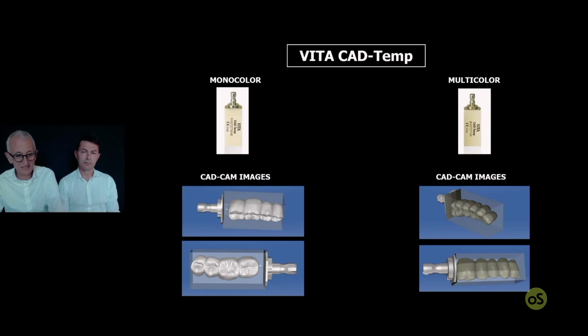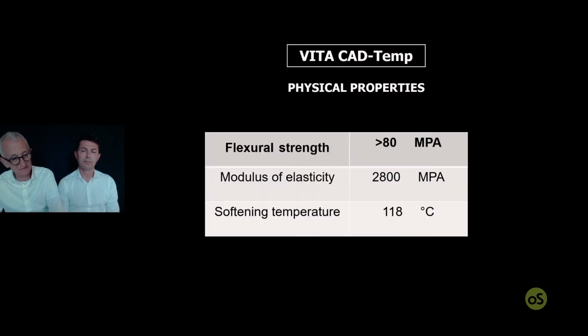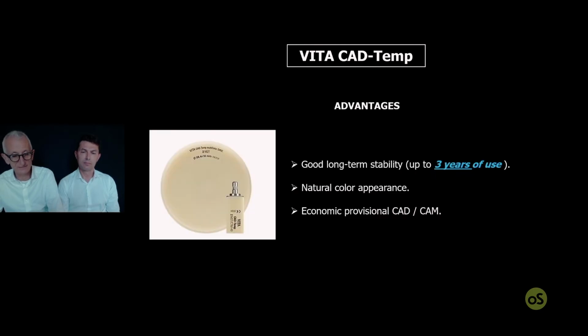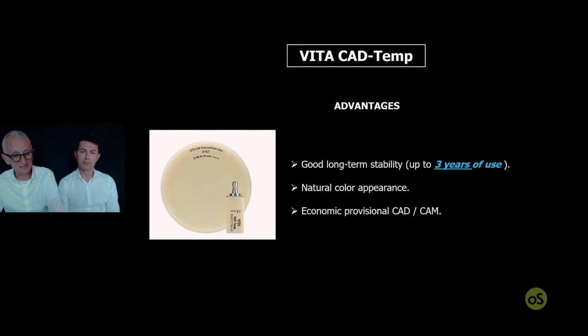So VitaCAD can be monocolor, multicolor, and here there is the description of the inorganic microfillers that are polymerized in a network that give us good properties, although as you see, not a very high flexural strength resistance.